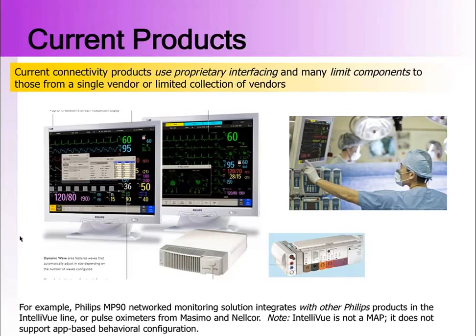Why is this not a medical application platform according to our definition? First of all, we want our platform to be open and extensible. Here this system was built and designed to work with products from a specific vendor, namely Philips' own products. They also had a few contracts with companies like Masimo and Nellcor to provide some pulse oximetry components. But it's designed from the outset to be a closed system working only with their components. It also doesn't provide any way to extend the functionality or the application logic. It's just basically displaying information, and you're hard-coded with the functionality that comes built into the product.